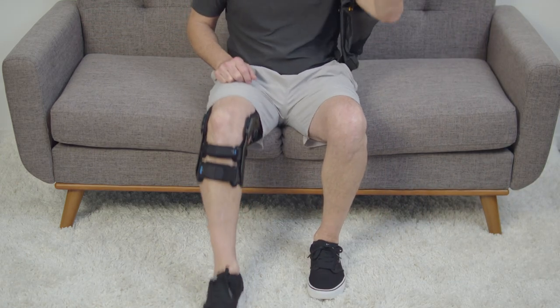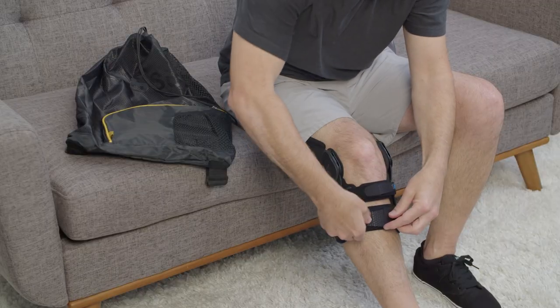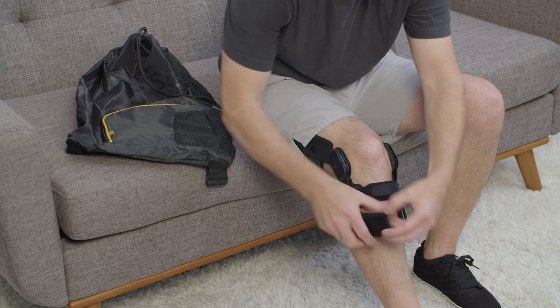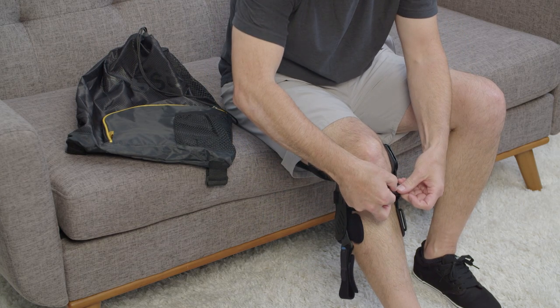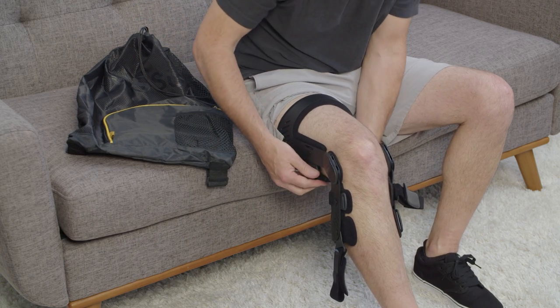Sit down and bend the knee to between 30 degrees to 45 degrees. Unfasten the back straps on the upper frame and the front straps on the lower frame of the device, and attach the straps back to themselves. This will make it easier to put the device on next time and will also prolong the life of the straps.